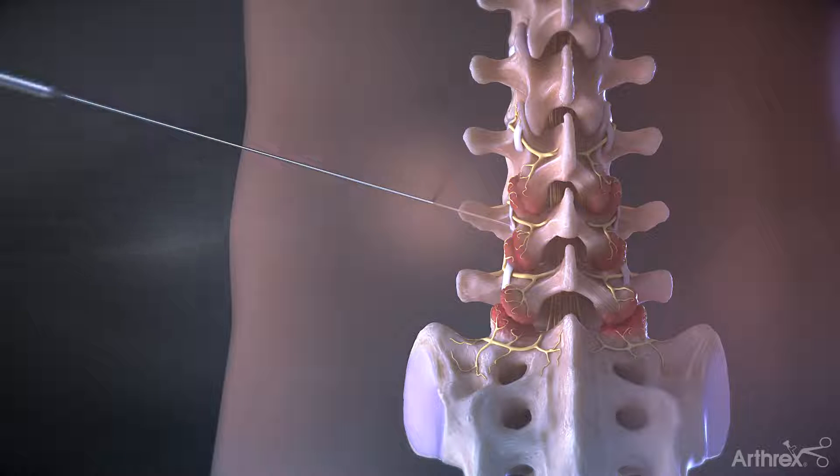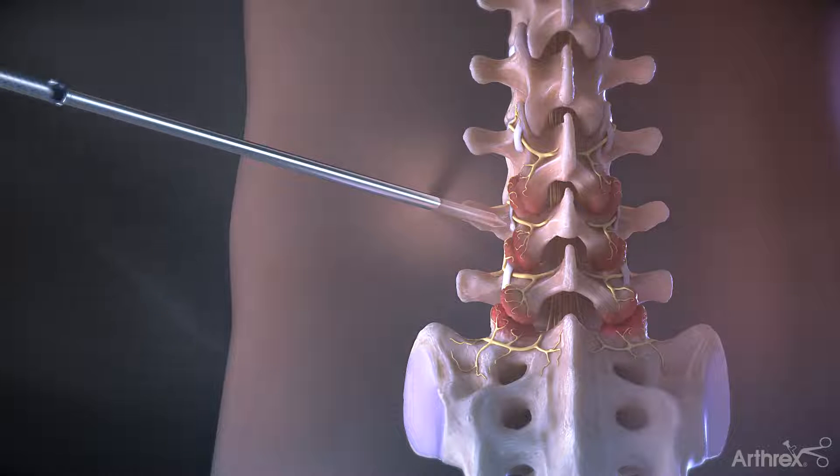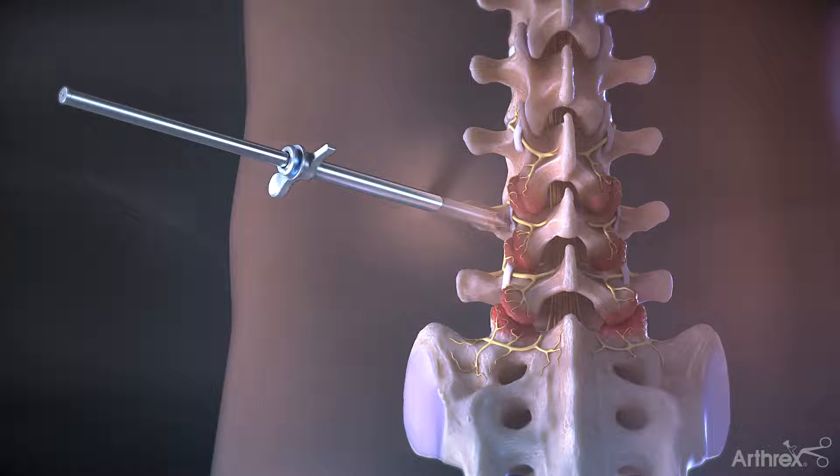Insert a switching stick over the guide wire. Insert the cannula with the opening of the cannula oriented up and medial.